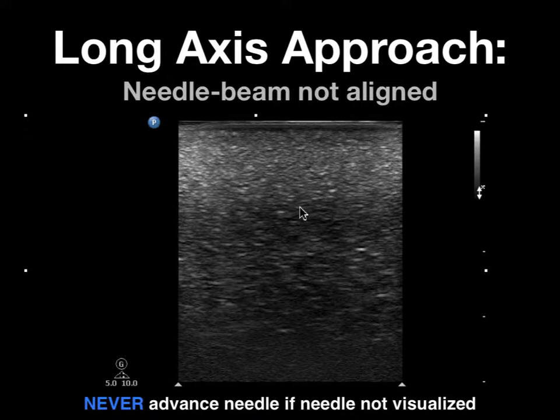So a key thing to remember: if you don't see the needle, don't advance any further. You've got to then realign the transducer with the needle before moving any further. The answer is never to advance the needle further. That will not help you reobtain needle visualization.